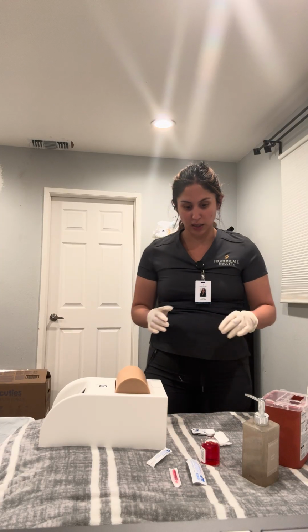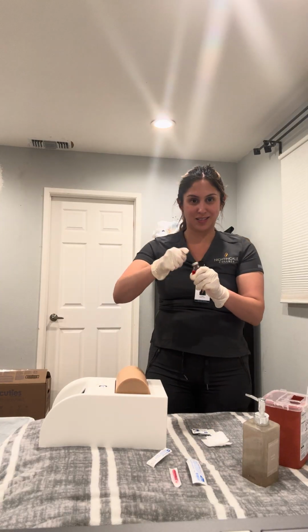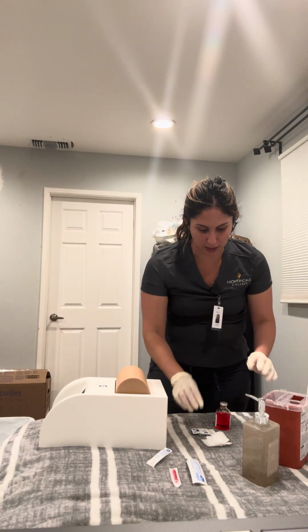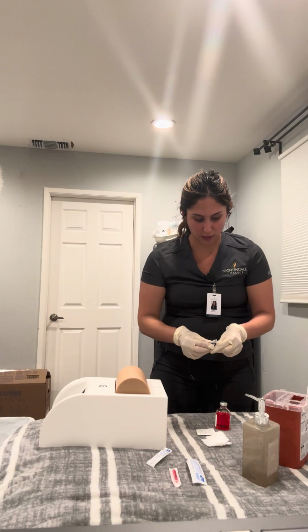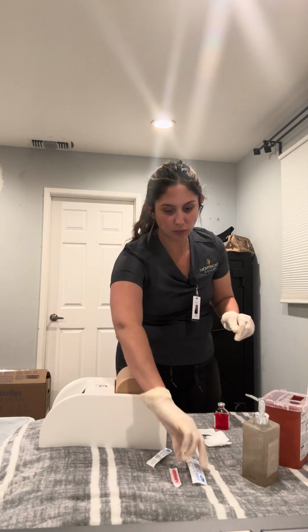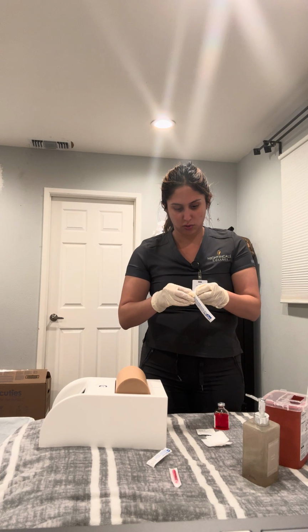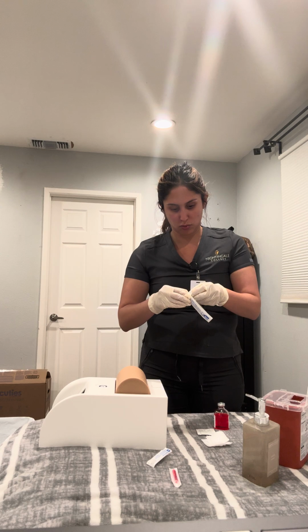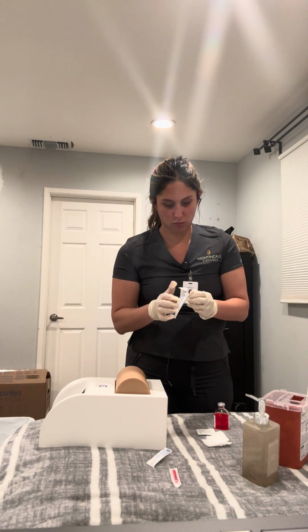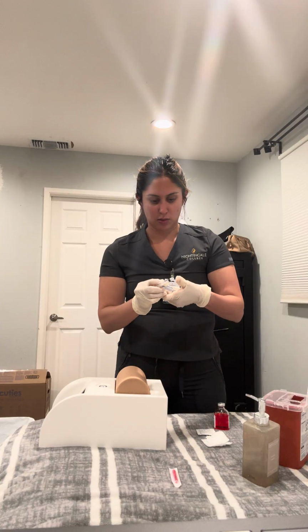No, perfect. Okay, so I'm going to grab my medication, uncap it, and clean the vial, just like that. We're going to grab our syringe and our needle.